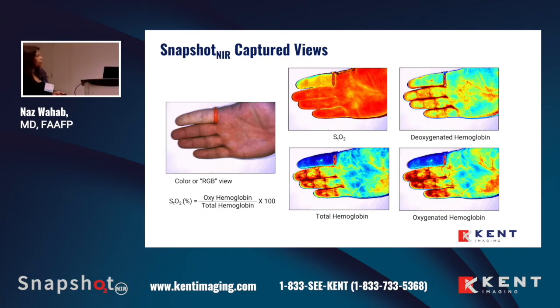I put this up for two reasons. One is that this is something immediate that you can see. We'll actually do a demonstration today for you guys to evaluate that. If you put a tourniquet on the finger, you will see up to 4 different images, depending on how you look at the interface. Here you have the oxygenated blood. You have the oxygenation percentage, you have the total hemoglobin, you have the oxygenated hemoglobin, and then you can break that down even further to the deoxygenated hemoglobin.